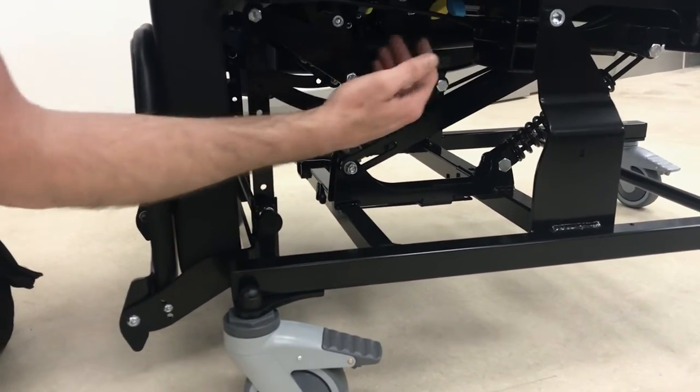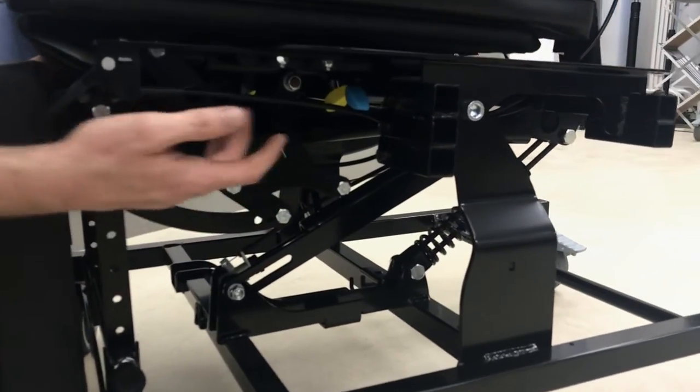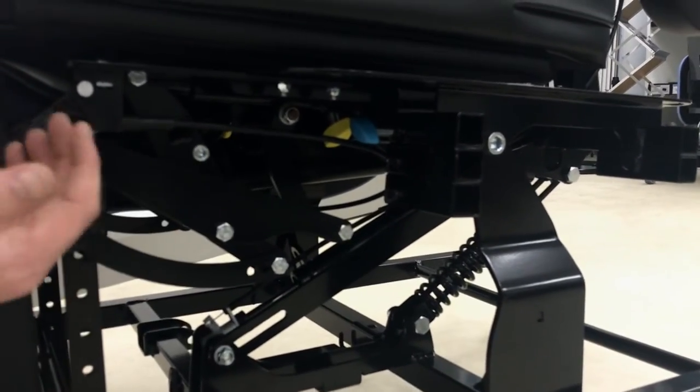So where the gas strut is, if you want to bring this leg rest forward, just loosen up the two yellows on either side of the leg rest and you can pull that forward to give yourself more access.